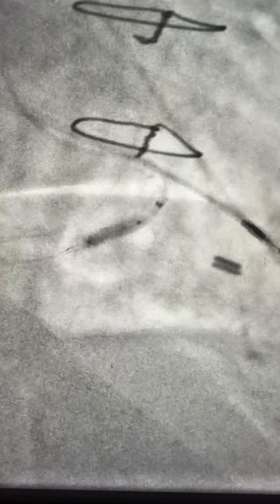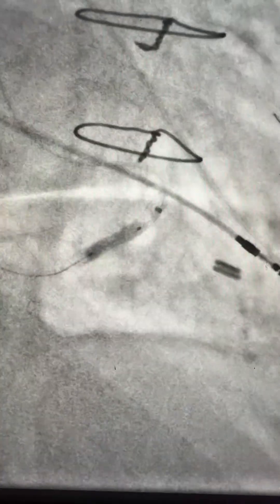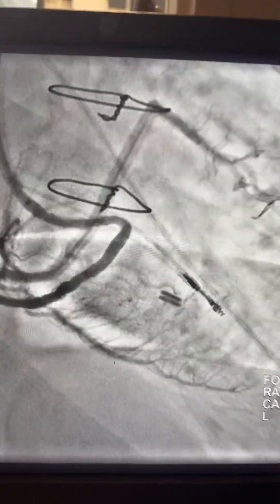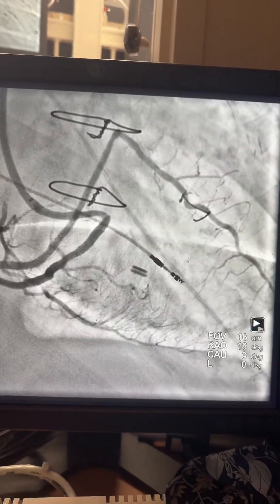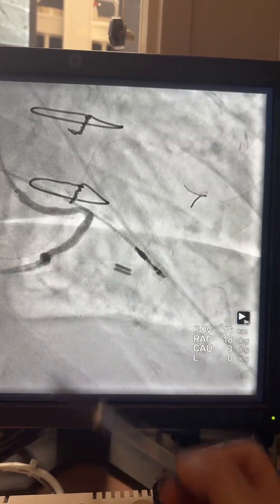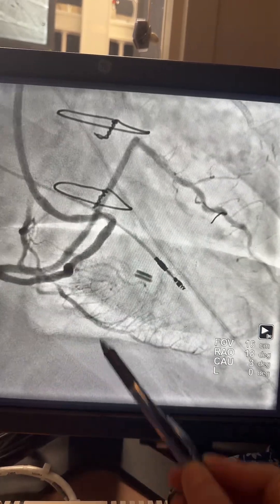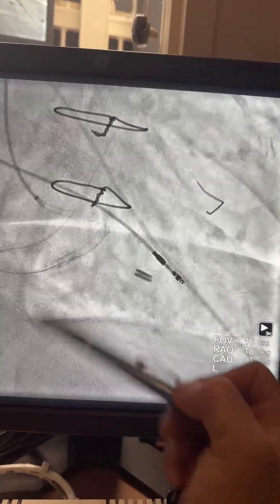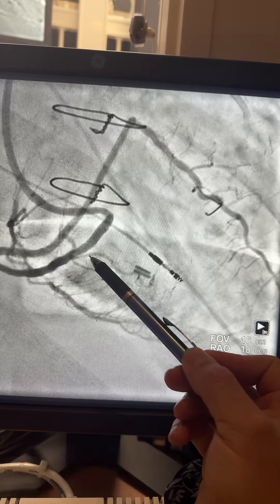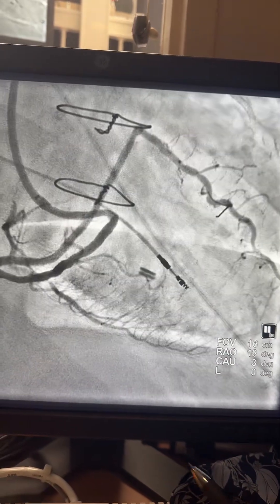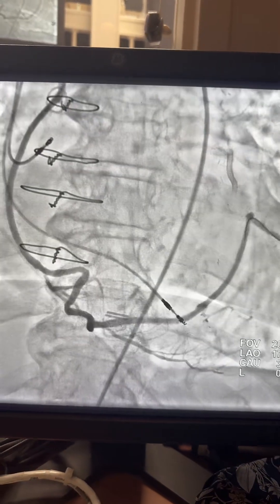We deploy a 3.5 stent, post-dilating using a 3.5 NC balloon. Here is the final result view — we have very nice flow towards three branches: right PDA, OM from the circumflex or LPL, and the major OM branch. And here is the frontal view.